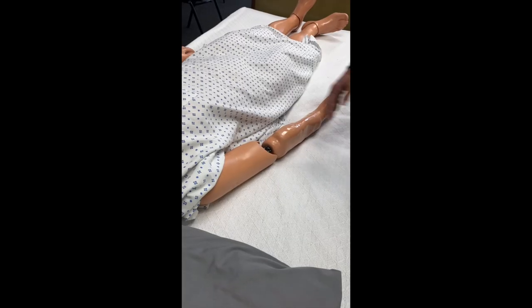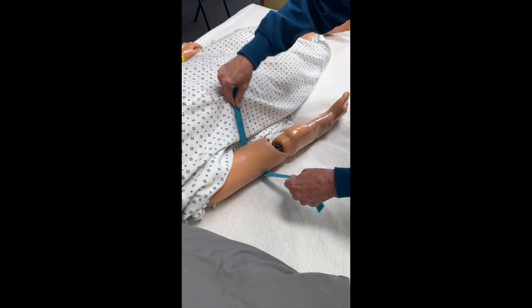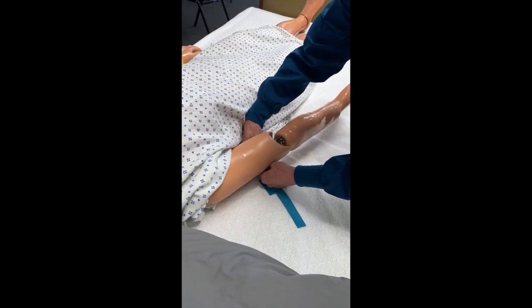Today we're going to learn how to tie a tourniquet. Step one: place the tourniquet laying flat underneath the arm. Make sure it is three to four inches above the elbow.